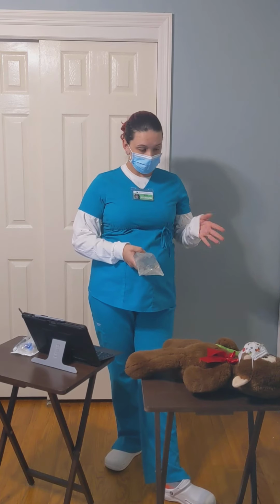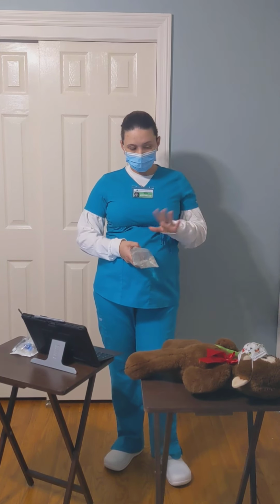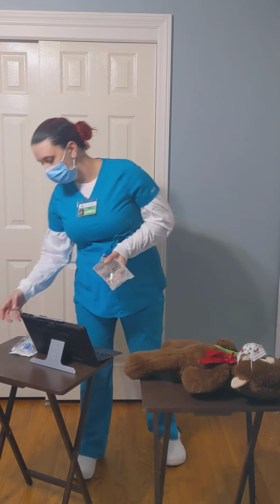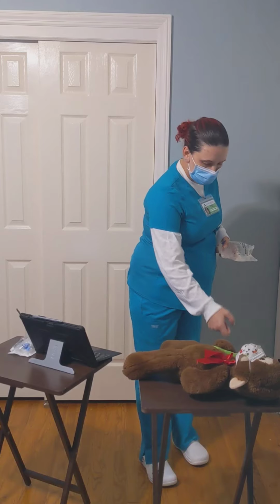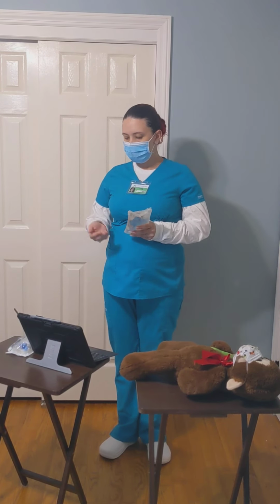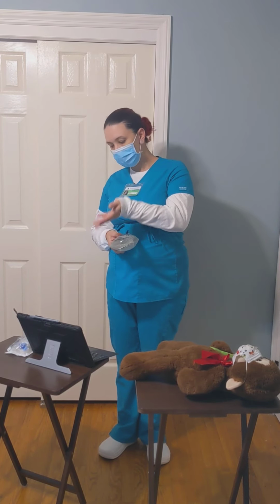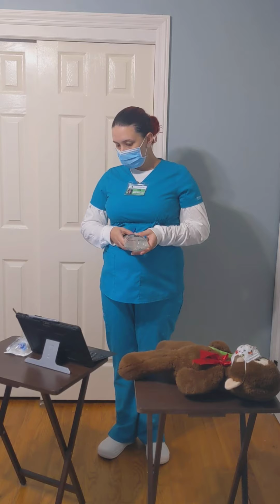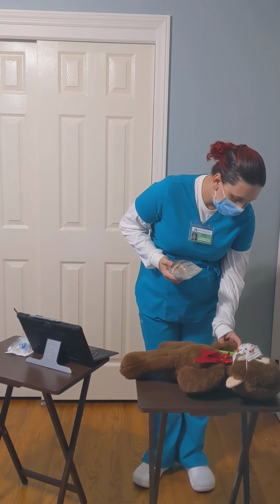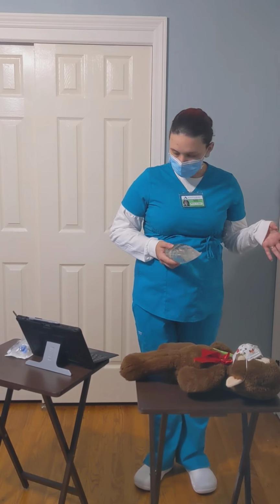Do you have any allergies to any medications? Okay, so she has no allergies to Zosyn or penicillins or anything else that would be concerning. So I'm going to scan the patient's armband and scan my medication. Do another check with the MAR, right patient, right med. This is the right time that this med needs to be given. So I'm going to assess her peripheral IV site, and it looks good. There's no signs of infiltration.